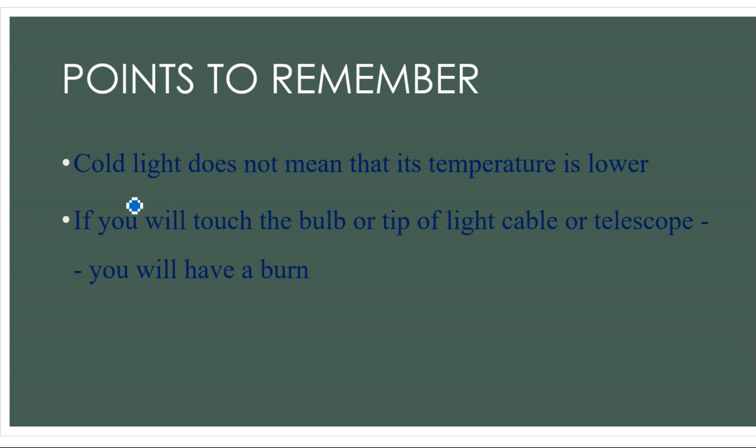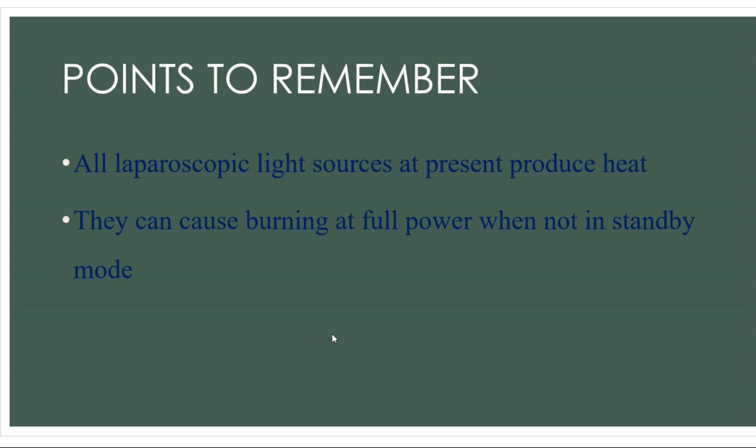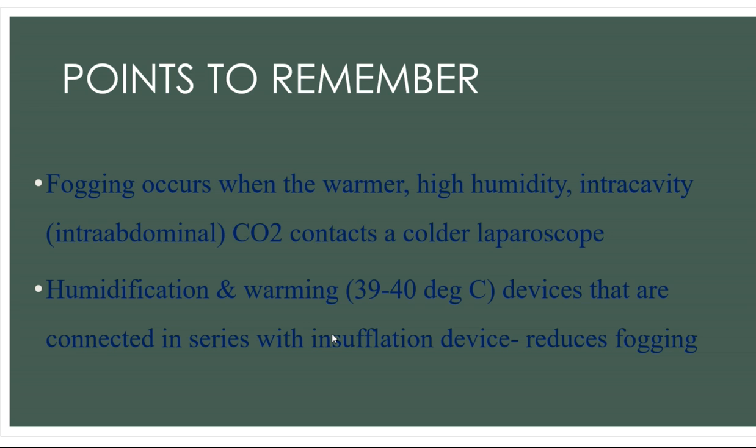So one thing is clear: cold light does not mean that its temperature is lower. Even with the cold light, if you touch the bulb or the tip of the light cable or telescope, you will have a burn. Definitely you will have a burn. So cold light doesn't mean lower temperature. All laparoscopic light sources available at present produce heat and can cause burning at full power, whenever they are not in standby mode and we are not using them. At that time there is a higher risk of touching the tip, right? So always be careful regarding this.